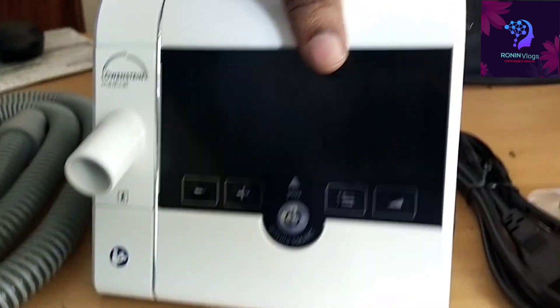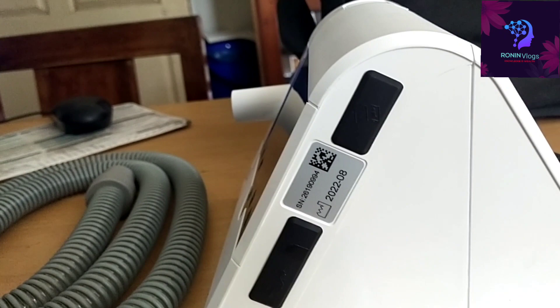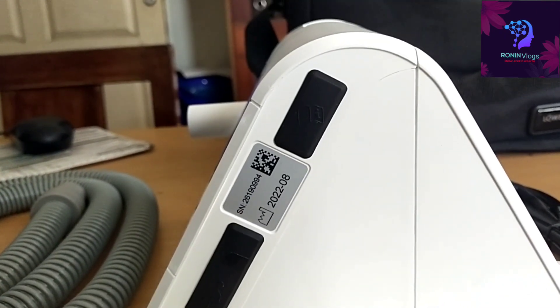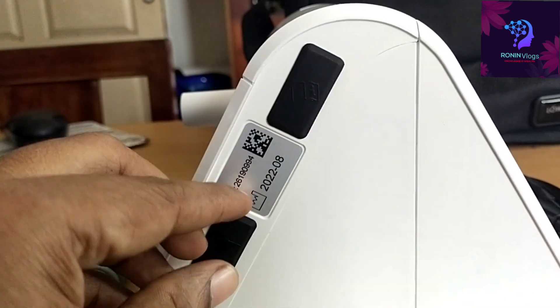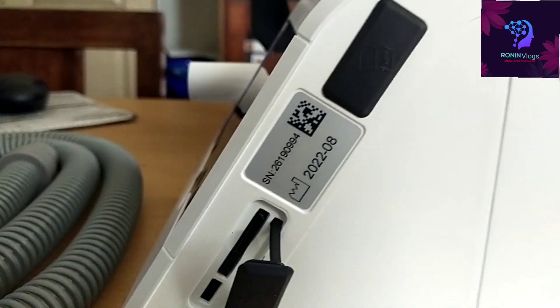This is the Lovisin Prisma model CPAP machine. Here we can connect a memory card, and also a pen drive or computer if you want to connect. If we need to connect through Bluetooth, that is also possible.